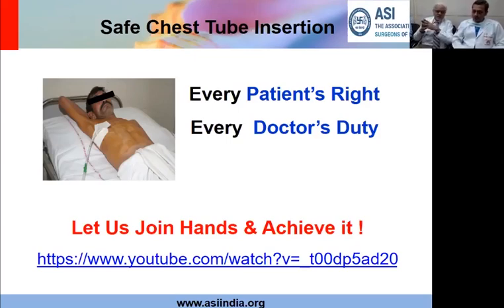One question has come up, and you also touched upon this aspect in your presentation. That was pleurodesis. So that's related to intercostal drainage as a bridge to pleurodesis in certain patients. I believe that most of the time it's thoracoscopic, but in some situations you do intercostal drainage in the beginning, and subsequently you go for pleurodesis. What is your regimen? Yes, so what you use and what regimen depends on the cause.